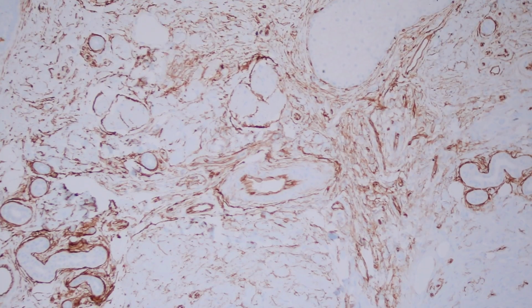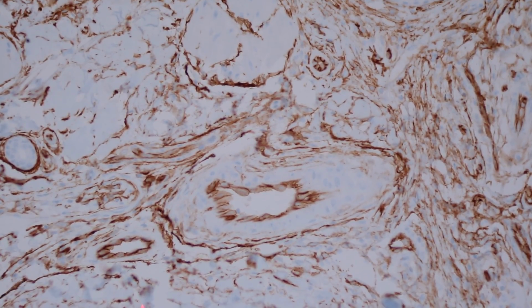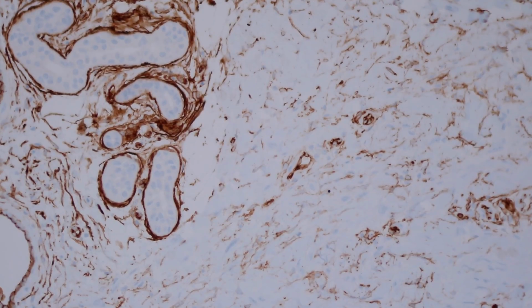The other thing is that if you look at a blood vessel, like right here, you can see out around the outside of the blood vessel, the muscle layer is negative, but the spindle cells in the dermis are kind of wrapping around the vessel and they're positive. And then the endothelial cells lining the lumen of the vessel, they nicely stain with CD34, and they'll stain with other vascular endothelial markers like CD31 and ERG as well. Okay, so they do stain endothelium, but they stain lots of other things.